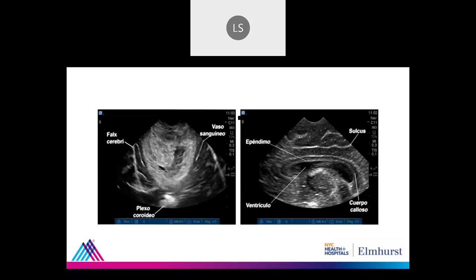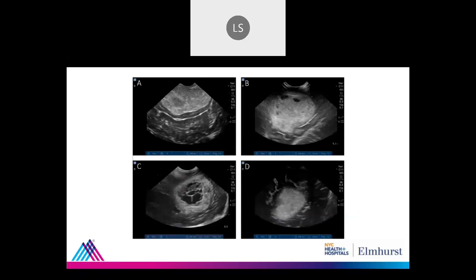And this is the aspect of some of the most common tumors in the brain. You want to take a guess of what they are? So it's very heterogeneous. Each one is different. Okay, question.